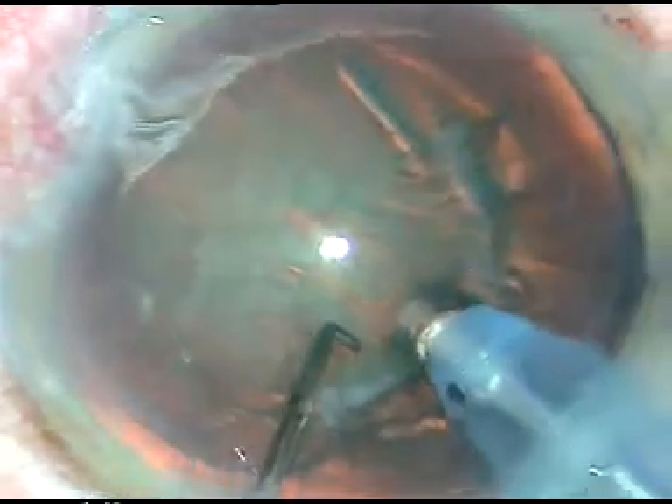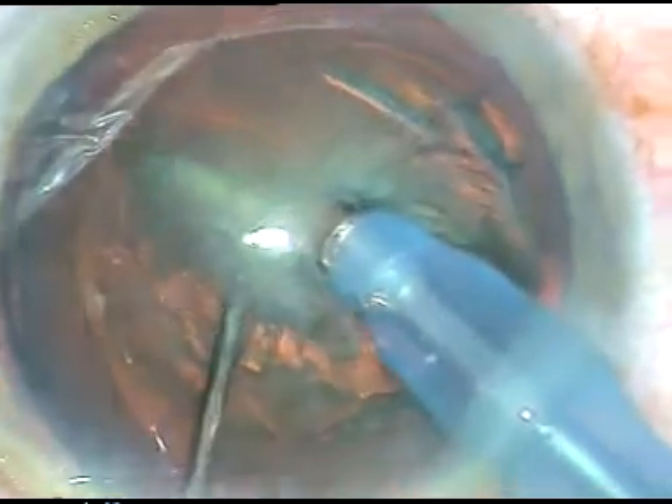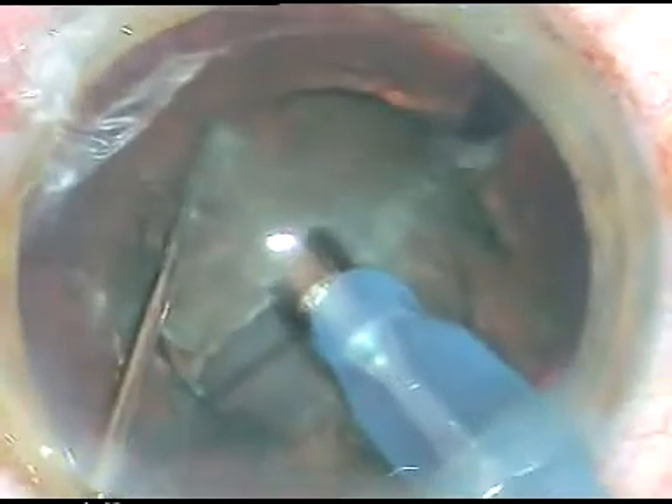But I will be able to hold it. Yes, I am holding it at the center and I just cut the nucleus into two halves with the chopper. Hold it again and divide the hemi-nucleus into two parts. This other hemi-nucleus is also divided into two parts. I am in FACO 2 mode from the beginning. The FACO power in this case was 45%, fluid flow was 40%, and vacuum was 400. All four fragments are emulsified and removed.